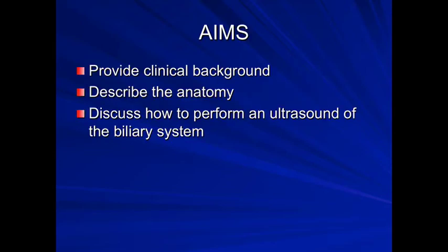First of all, we're going to quickly run through some of the clinical background as to why we may wish to perform a biliary ultrasound. Then we're going to talk about the anatomy of the biliary system, and finally discuss how one actually performs an ultrasound of the biliary system.